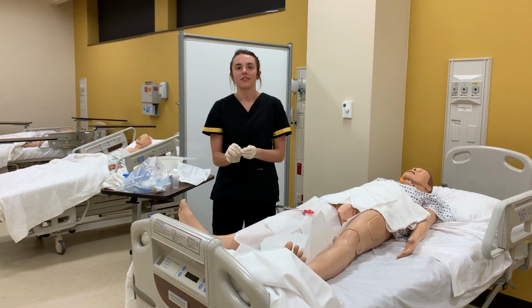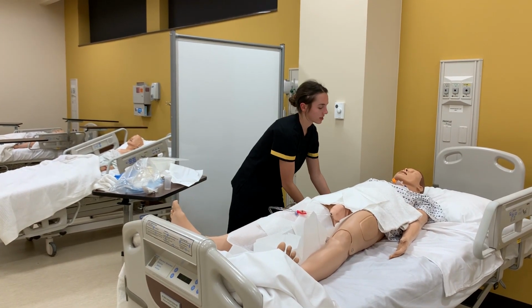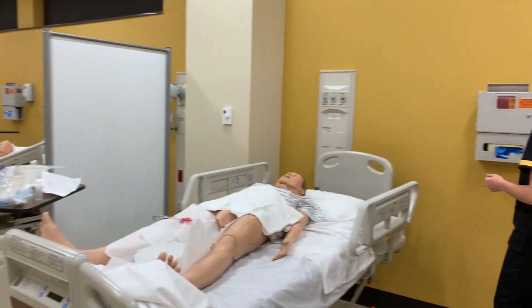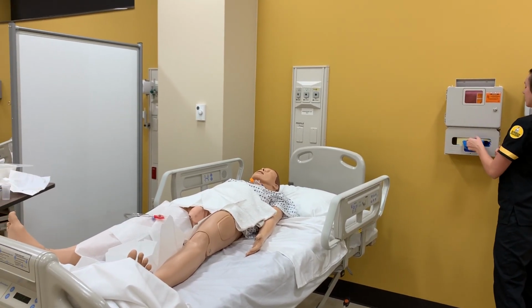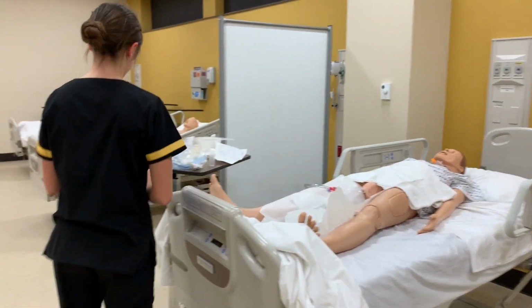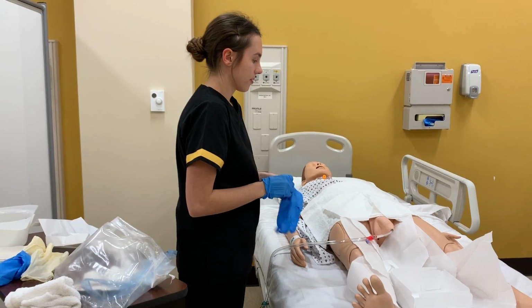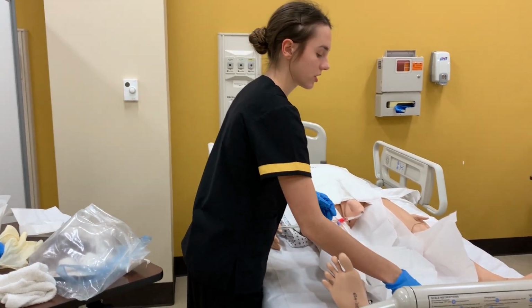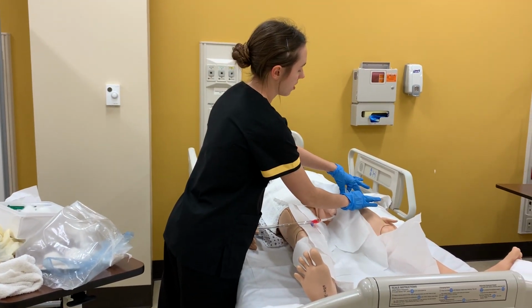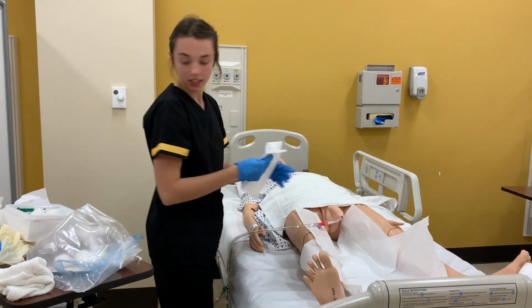And so I would take off my sterile gloves and go get some clean gloves, since this is just a clean procedure. And there we go. And now we are going to take a clean sample. Since we have everything inserted properly, we can go ahead and take these drapes off and remove this. And then we're also going to tape it to the abdomen.